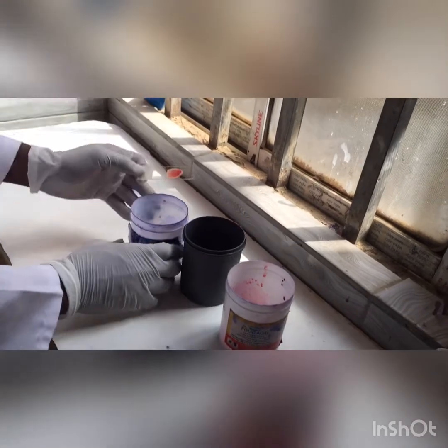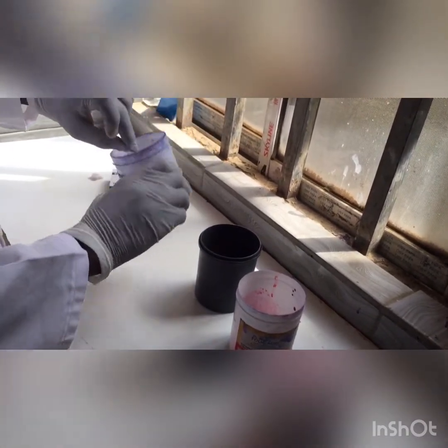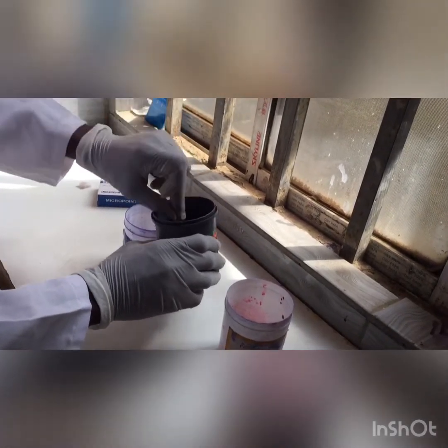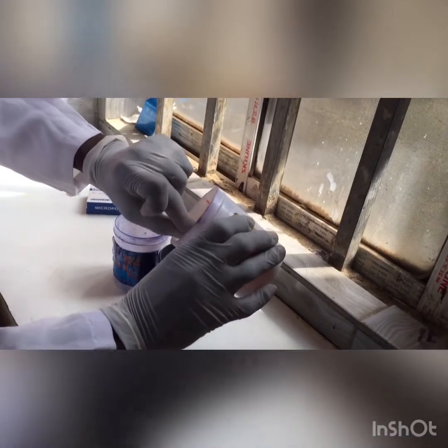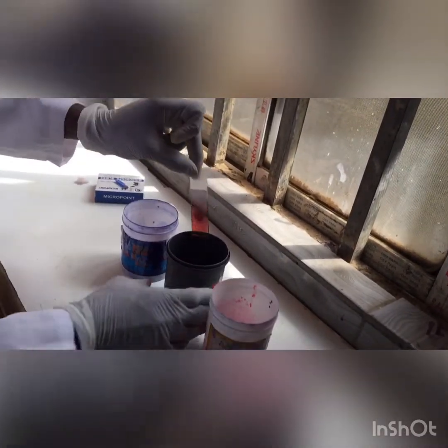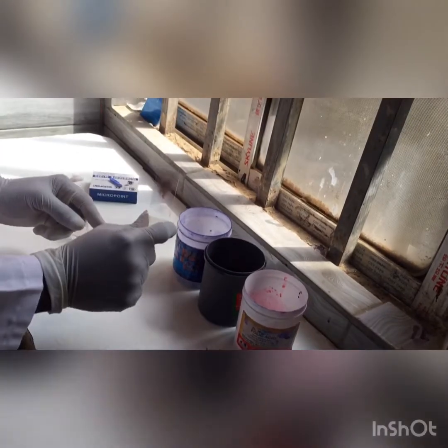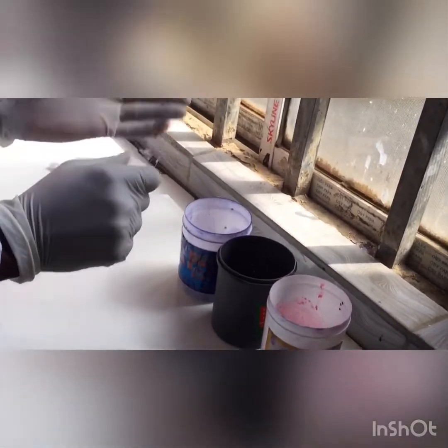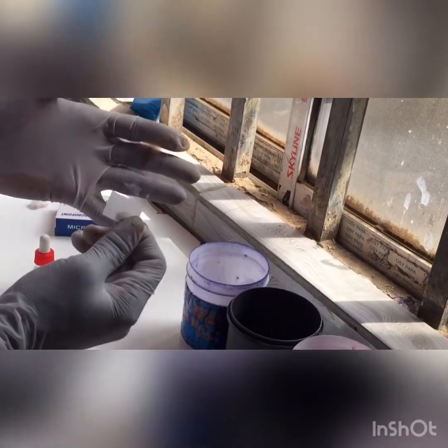So watch this: 1, 2, 3 in my water — 1, 2, 3, remove. Now in my Field stain B: 1, 2, 3. In my water again: 1, 2, 3. Now this is my stained thick blood smear. After dipping it in my Field stain and in my water, I allowed it to dry for about 10 minutes and you can see it's all dry.